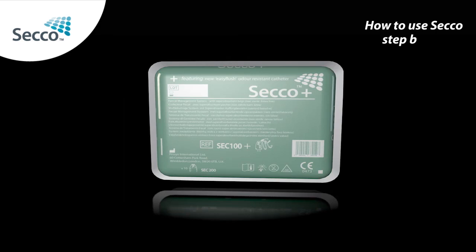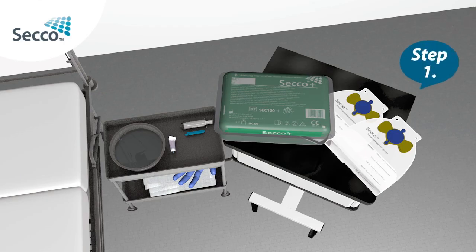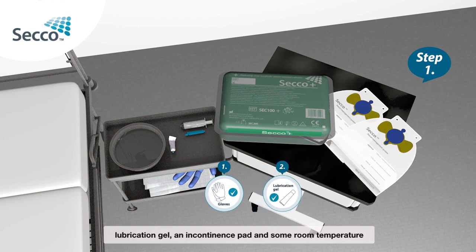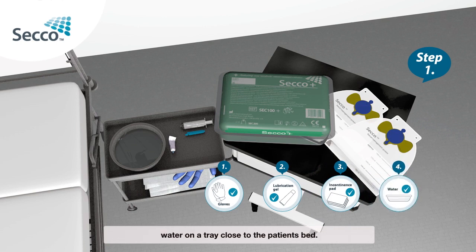How to use Secco step by step. Step 1: Put on your gloves. Gather together Secco, a water-based lubrication gel, an incontinence pad and some room temperature water on a tray close to the patient's bed.